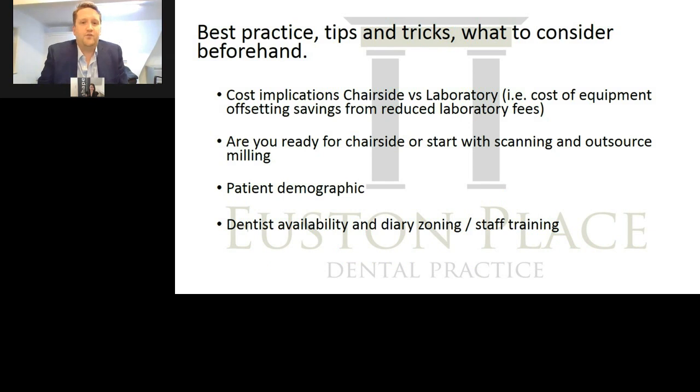Tips and tricks and what to consider. So cost implications, we covered that briefly. So that's the offset of the lab fee versus the cost of the equipment. Again, as Jenny was saying, do you want to actually be scanning and milling, or do you just start with scanning, see how you get on with that? And that's exactly what I did. I started scanning, making sure I got on with the scanning, outsourcing it to a lab, and then milling at the lab and getting them back. And then once I was comfortable with the scanning, I was happy with the fit of the restorations, then we added the milling in later.